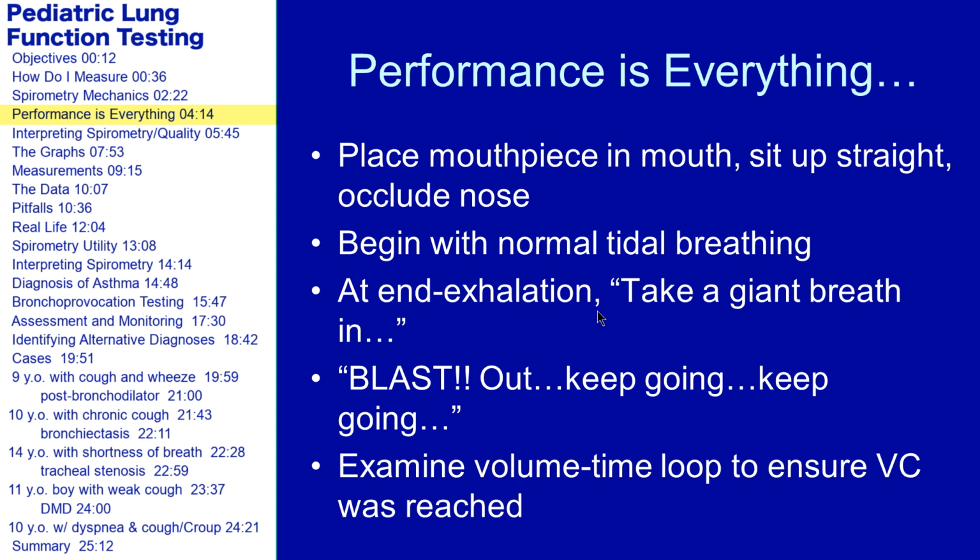The key piece of doing spirometry is getting good quality data, and this really comes down to getting a child to perform the procedure in the appropriate way, and ultimately it comes down to having good PFT techs coaching them through the maneuver. So what you want is to have the child place a mouthpiece in their mouth. They're sitting up straight with their feet on the floor. The nose is occluded either with their fingers or with a nose clip, and they'll start with normal tidal breathing so that you can see the signal on the screen that you're measuring.